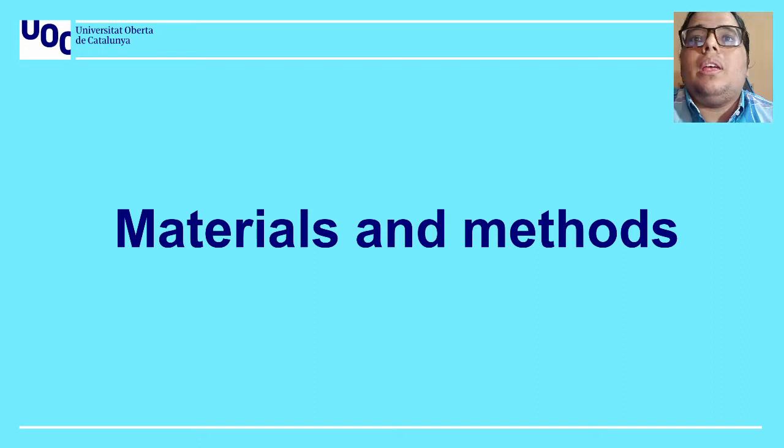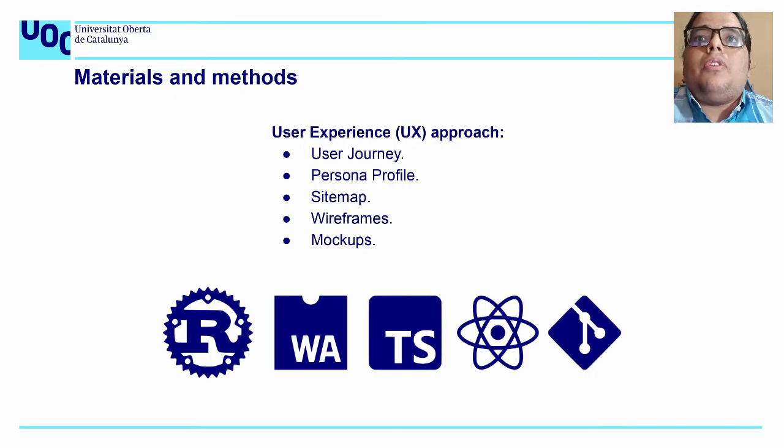Materials and methods. For the user experience approach, we have to develop the user journey, persona profile, sitemap, wireframes, and mockups. Also, to perform this development, the language we need is Rust, which is a low-level secure language.